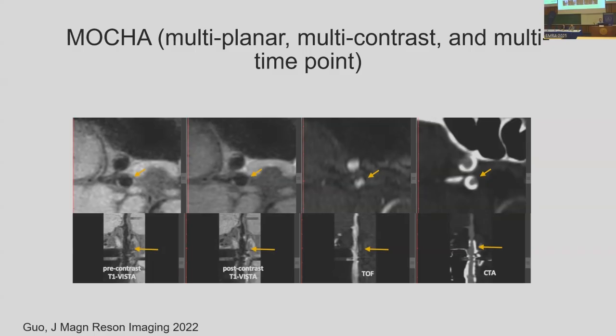If you look at these images, the last image, in fact, is the CT based image, and where the calciums are, this is a highly calcified lesion. On MR images, they're almost completely missed if you don't look at them carefully. But if you look at the time-of-flight and also black blood images together, you can actually appreciate where the calciums are and also the soft plaque. Both of these combined together and looked at this way can be very useful.